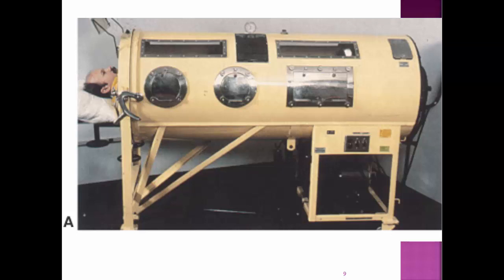And you can make out the rod. This is a leather attachment, or something similar to that, that moves back and forth, and it's propelled by this electric motor. So the further this thing moves, the bigger the tidal volume for the patient, the bigger the pressure gradient, resulting in a bigger tidal volume. And how many trips it makes back and forth determines the respiratory rate.